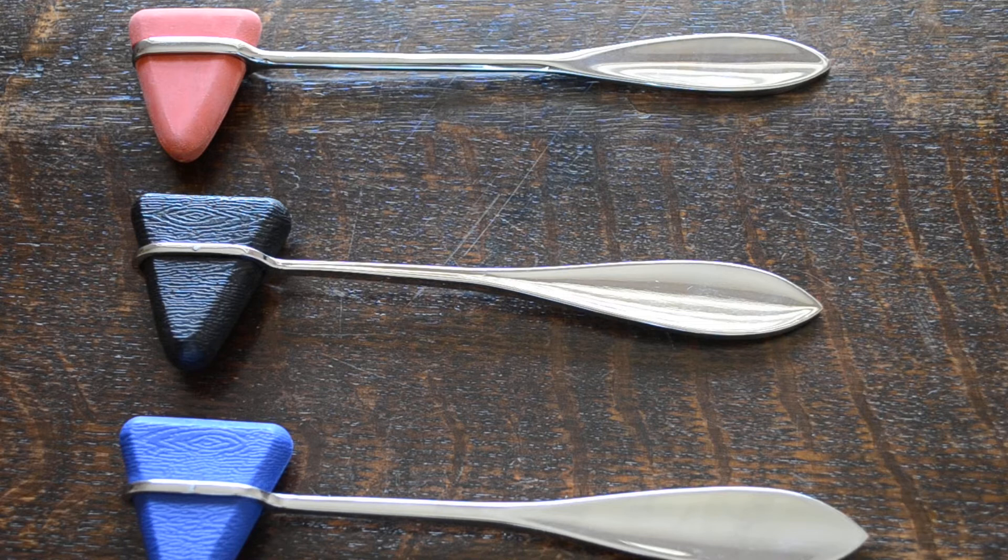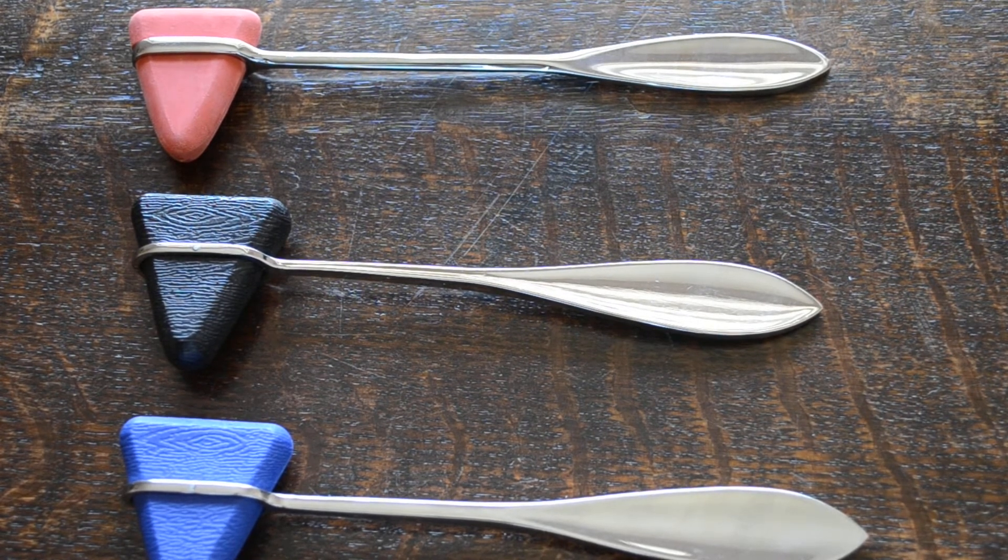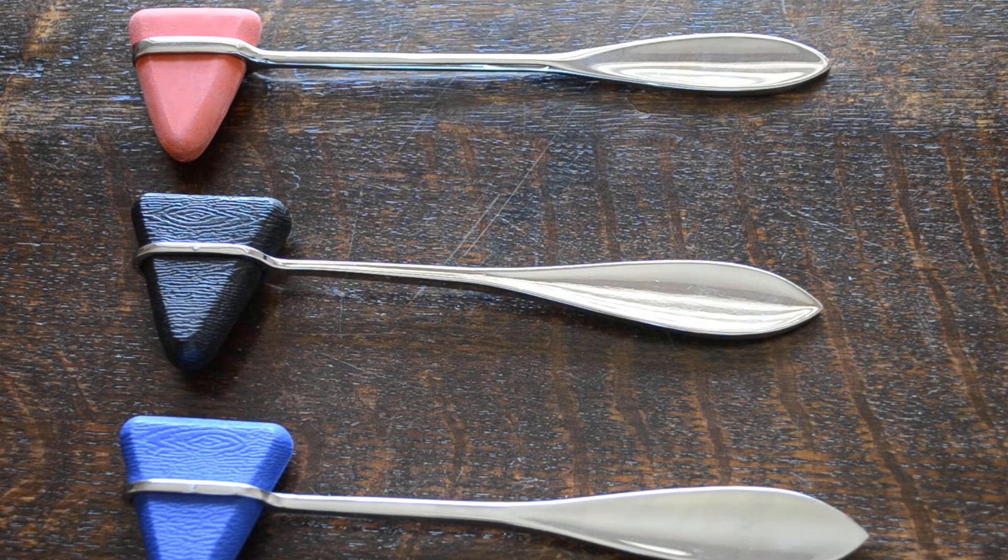Currently have three different variations or options available on the Taylor's. These are classic Taylor's designed reflex hammers. They're all very similar in size as you can see.